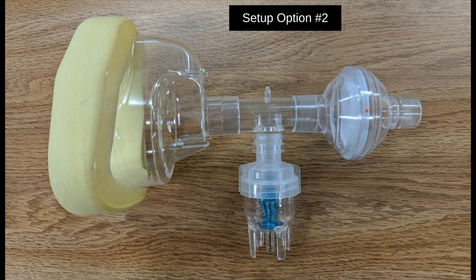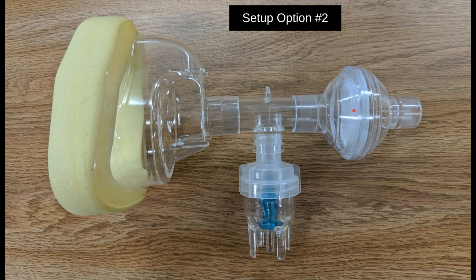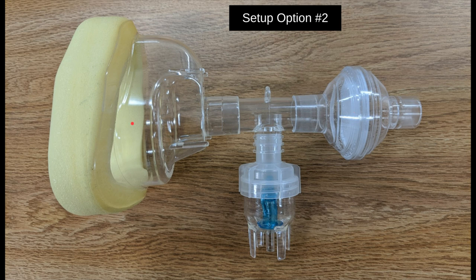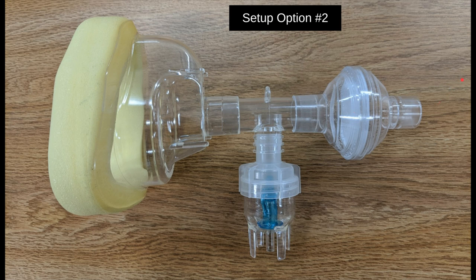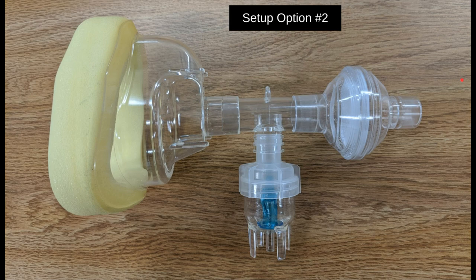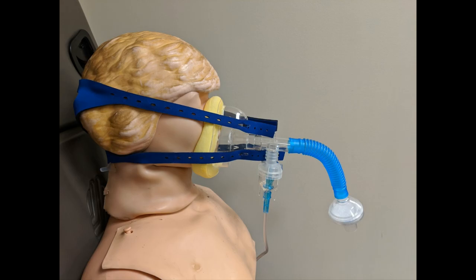The point here is to minimize, if not eliminate, aerosolized particles from a patient who presents with viral syndrome out into the air where we're treating the patient. This is what it might look like on an actual patient.